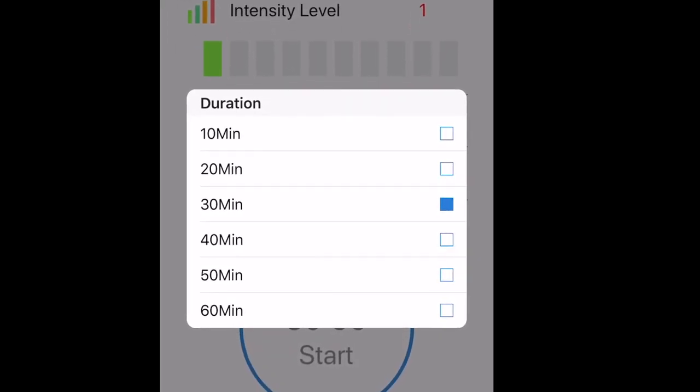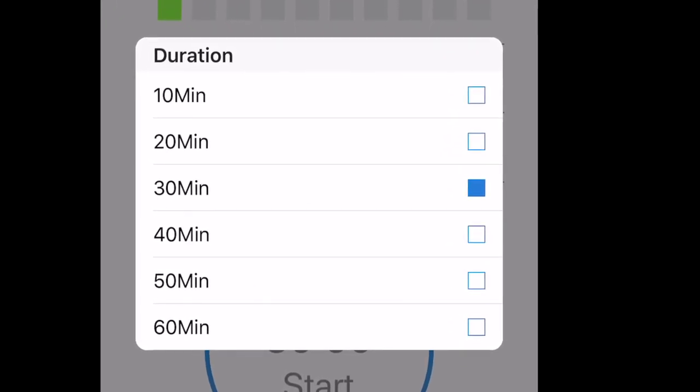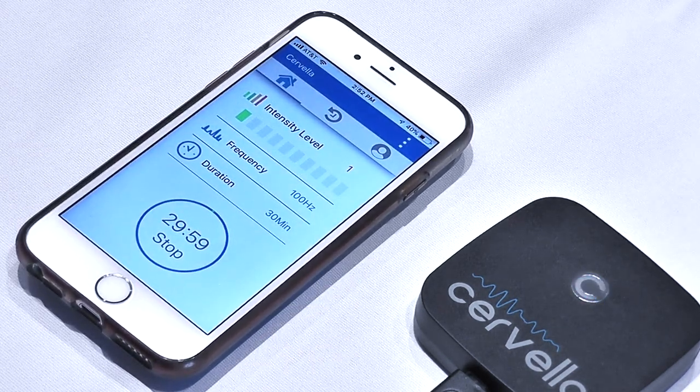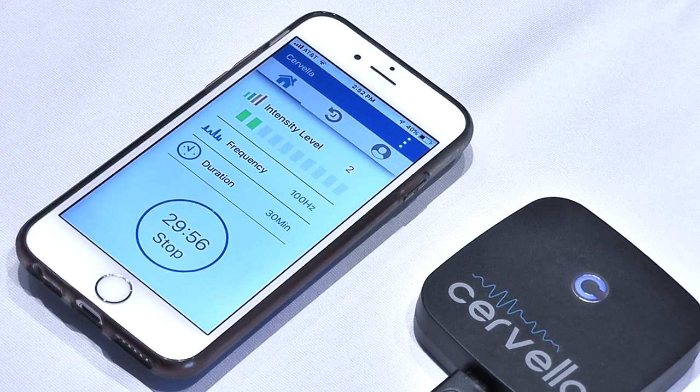Treatments in excess of one hour are typically not necessary, and treatments shorter than 20 minutes may not be effective. Press the circular button on the app to connect to Cervella. The LED indicator on the Cervella should turn on blue and be blinking, and the countdown timer should start.